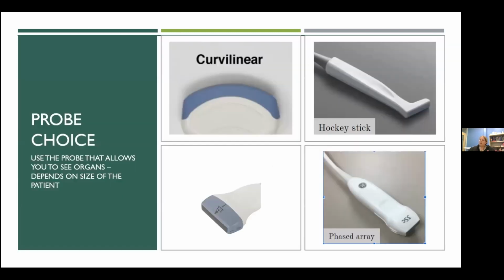The probe that I usually use here depends on the patient size. It can be really any of the probes. I have most commonly used my curvilinear or my phased array, but the linear and the hockey stick probes also will work, particularly in a smaller patient. Here, you're really not looking for the entire view of the abdomen. You do want to sweep through the entire abdomen, find all the organs, and have a sense of where your fluid is. But one of the primary things I'll show you is that you're looking on the surface for where the vessels are that you're trying to avoid with your needle sticks. Sometimes a combination of each of these probes will get you the information that you need.